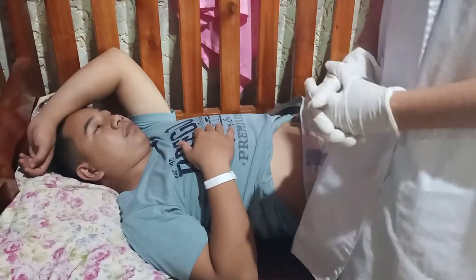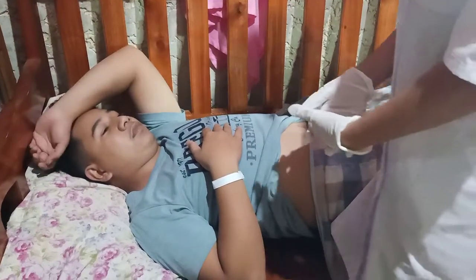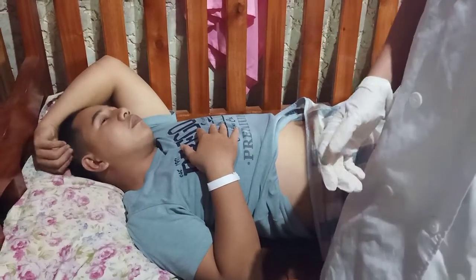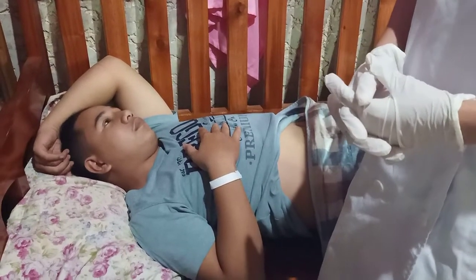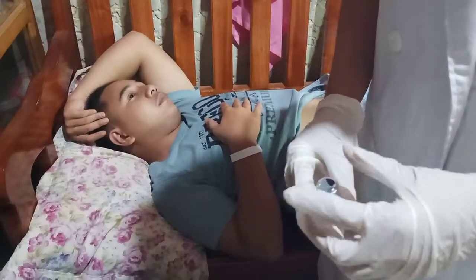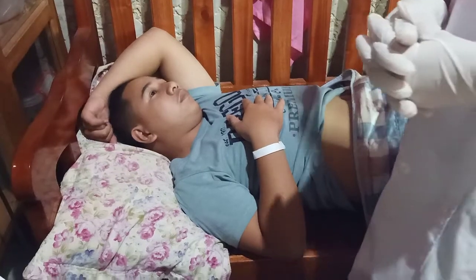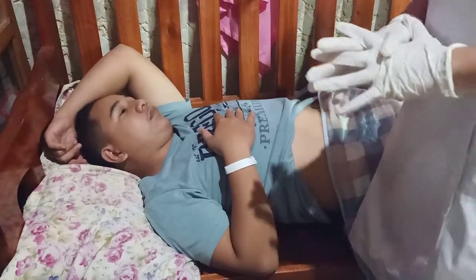Okay, so place the patient into a comfortable position. Sir, please relax your abdomen, okay? Yes, ma'am. And now, use the antiseptic swab to clean the top of the vial. And now, use the antiseptic swab to clean the site of the patient's abdomen.